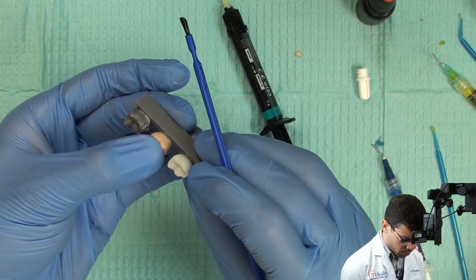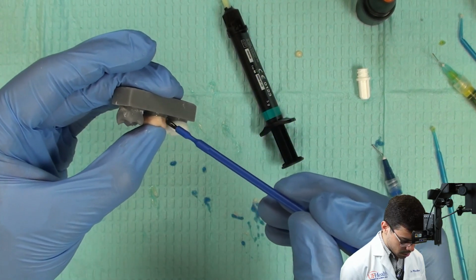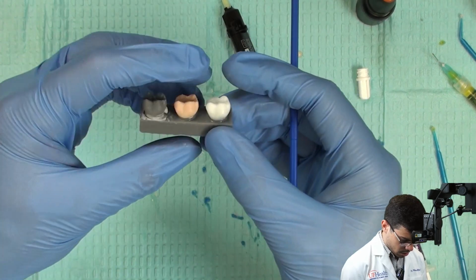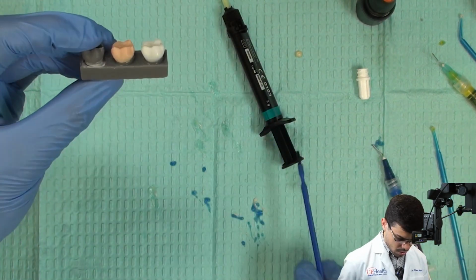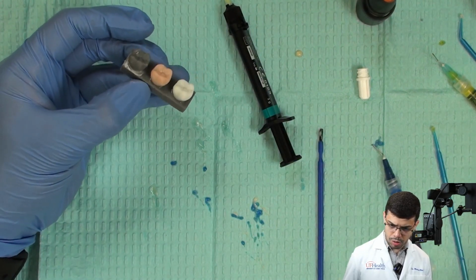So if that's on the rubber dam, that's fine. And I'm pressing here because I need to make sure that everything is well seated. Okay, let me remove the excess of cement here. All right, so once I'm done removing the excess of cement, I'm ready to light cure.